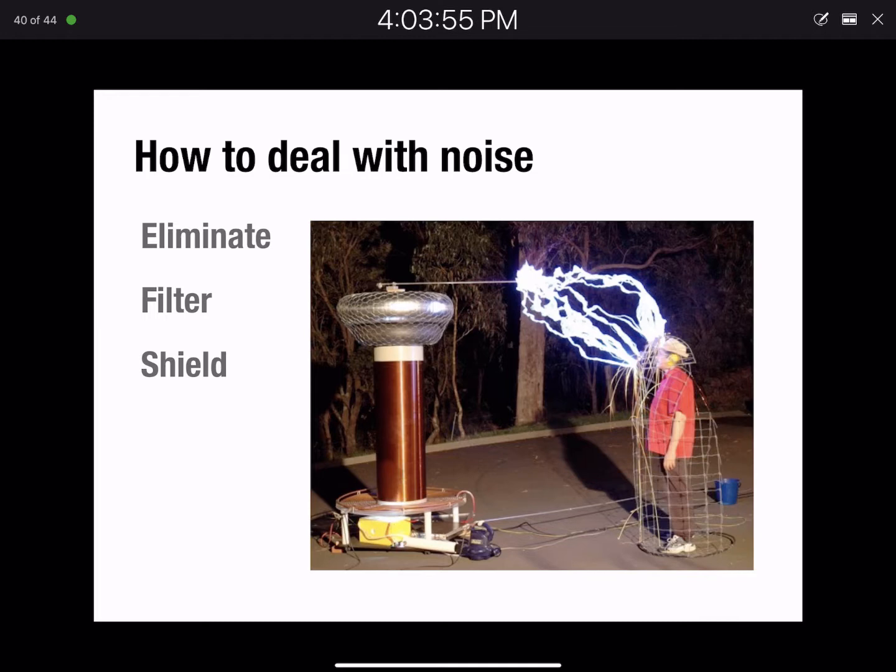Faraday cages can do a good job of keeping outside electromagnetic noise out of your booth. They don't do anything to remove any noise that's occurring inside the booth. And this is why they were, in the old school thinking, important. The new school thinking is that because these magnetic fields drop off sharply with distance, in most environments there aren't a lot of things generating electromagnetic fields so big outside of your EEG room that they're actually going to result in a big artifact inside.